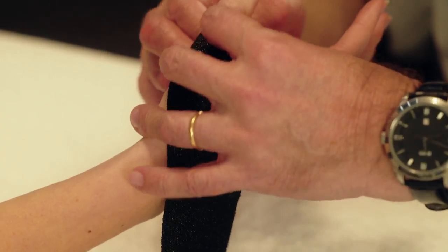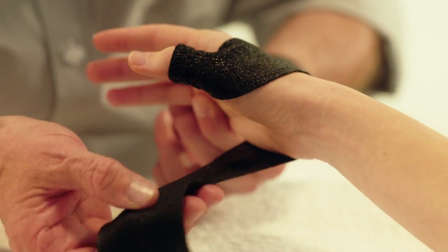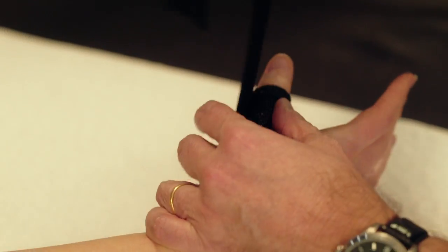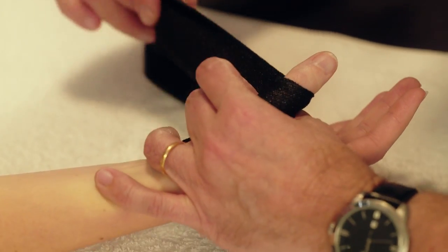Pass the material over the dorsal side of the hand above the wrist crease and around to the palmar side above the wrist crease. Wrap the dorsal part of the thumb a second time and make sure to cover the CMC joint of the thumb.